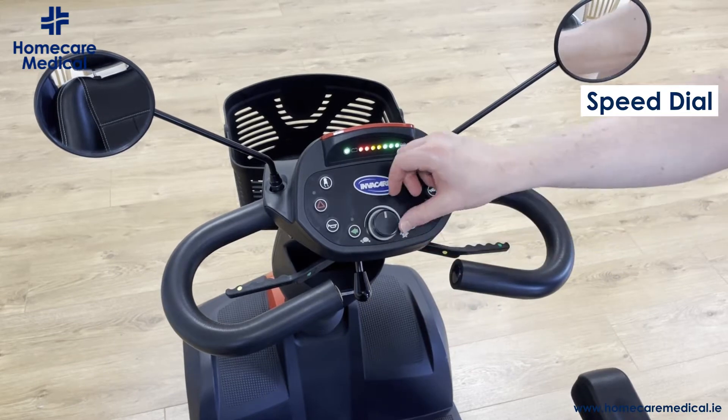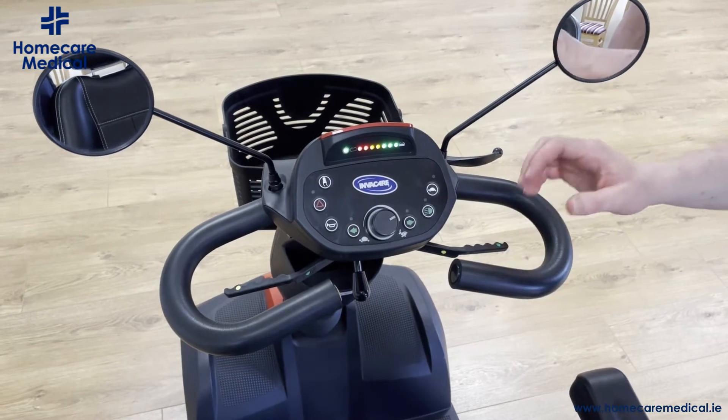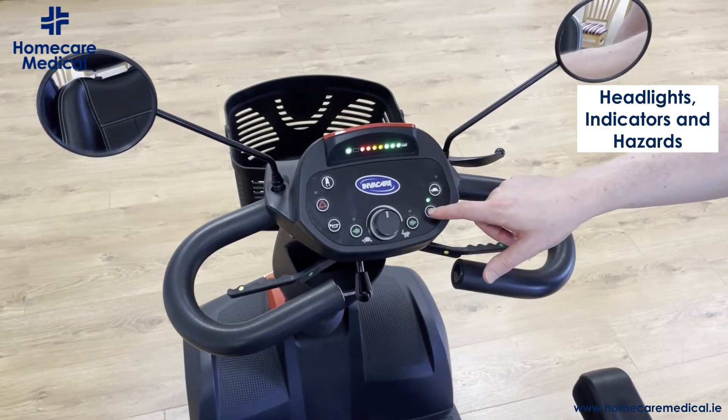Your speed is controlled by the dial here. If you turn it towards the left it will make it go slower; if you turn it towards the right it will increase the speed. The Orion has a maximum speed of 12 kilometers an hour. You also have indicators for both right and left.